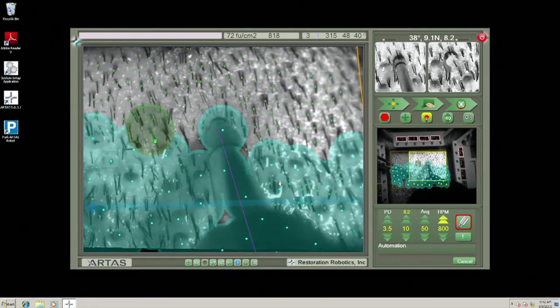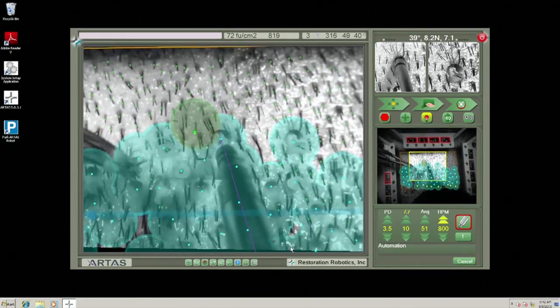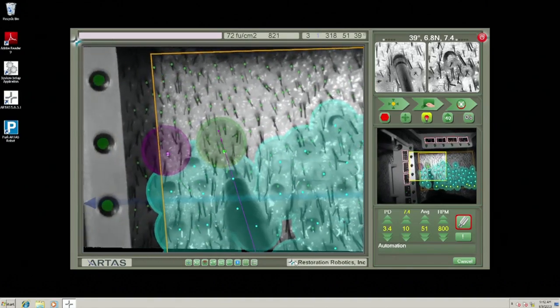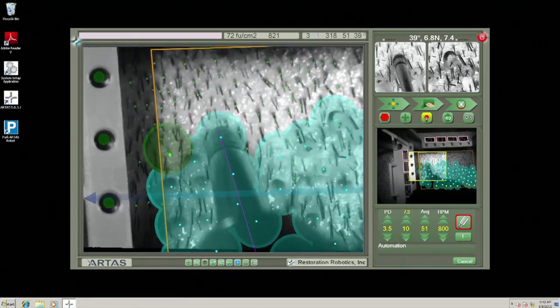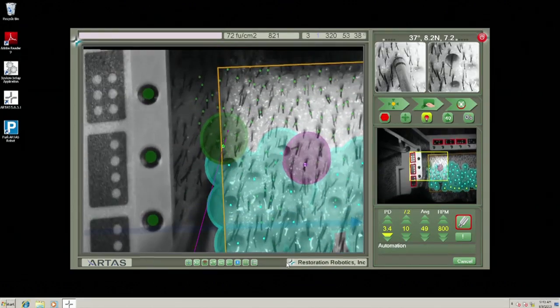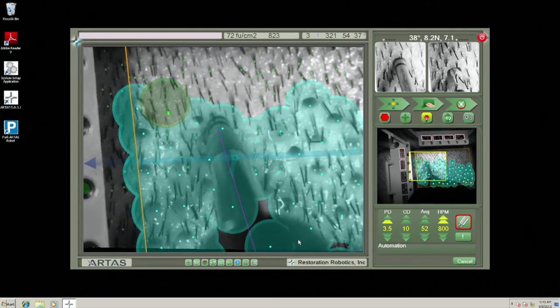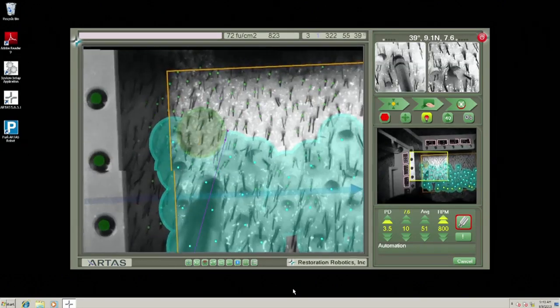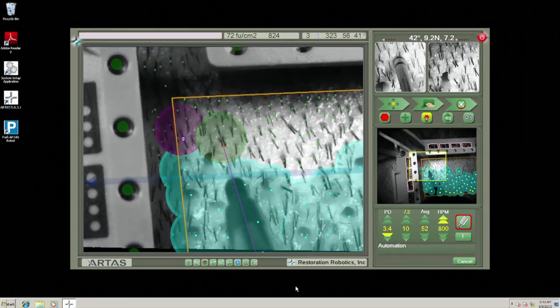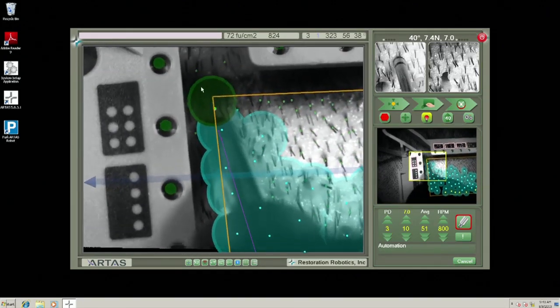I think the teaching, when people are using the robot, when they do your training, they teach you to start at the top and sort of march downward. Well, we've decided that because of the angle of the approach and the profile of the actual tensioner, if you start at the nape of the neck and you march upwards, you will be able to get on the order of about 20 to 30 more grafts without having to move the grid by getting an additional line. So you can see that you're able to get more of the grafts up in this region.